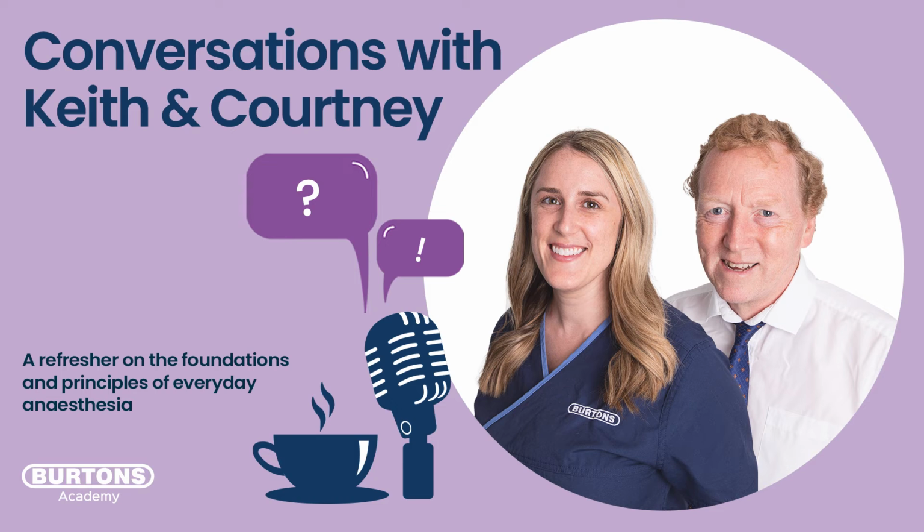And I've also seen where I've had the fresh gas flow rate way too high, so that what should be a nice smooth plateau in phase 3 is actually this bumpy little plateau because I've got this fresh gas flow whizzing past the sensor and disrupting that nice bit of breath. So there's so much we can gain from that waveform then.